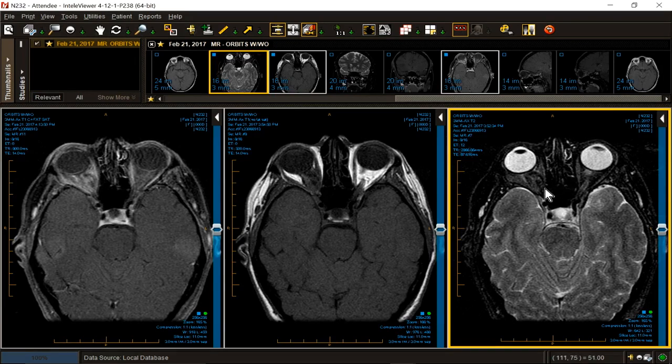What do they tell us? That we have a lesion that is very dark, which means it's desmoplastic, it's fibrotic, it's packed, it has very little cytoplasm, it's firm, it's hard, or it's calcified. Any or all of the above. Not a very good descriptive set of adjectives for optic nerve glioma.